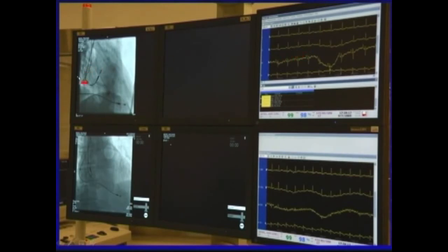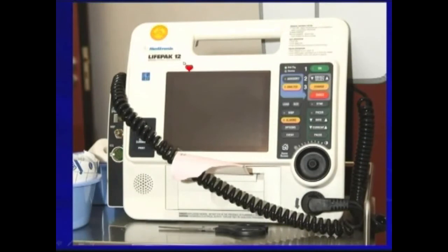Sometimes when we put the lead into the ventricle or atrium, it may provoke some arrhythmias. Although it's rare, sometimes it can provoke dangerous ventricular arrhythmias. So a defibrillator is also needed to stand by in case of emergency.